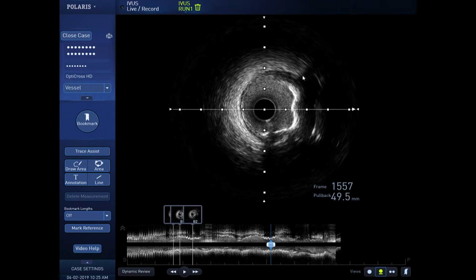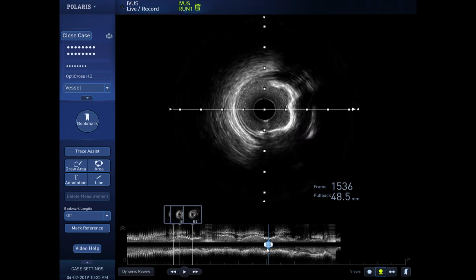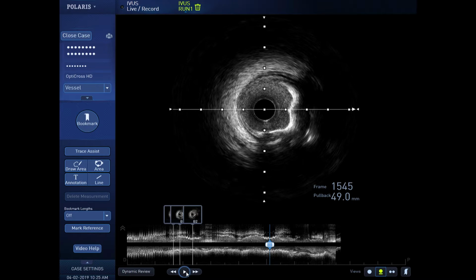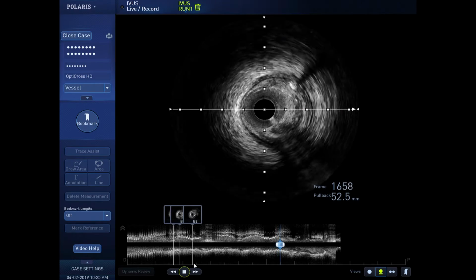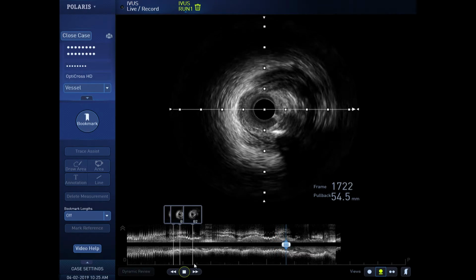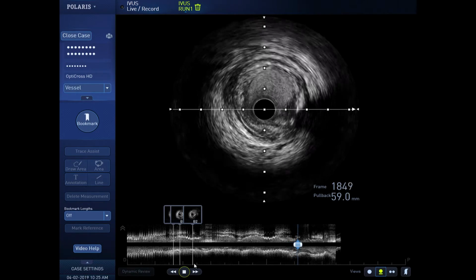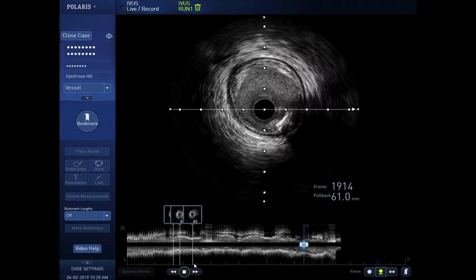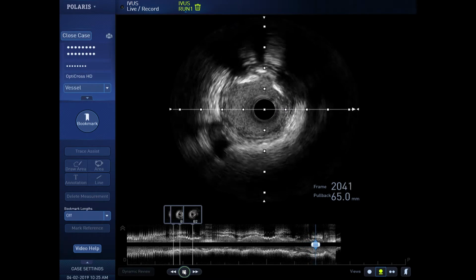And all the studies and guidelines say that if you want to understand whether there is calcium or not, you have to do intravascular ultrasound or optical coherence tomography to assess the calcium. And the guideline is that anything 180 degrees, that is the arc, 180 degrees or more becomes severe, and less than 180 degrees you can call moderate calcium.